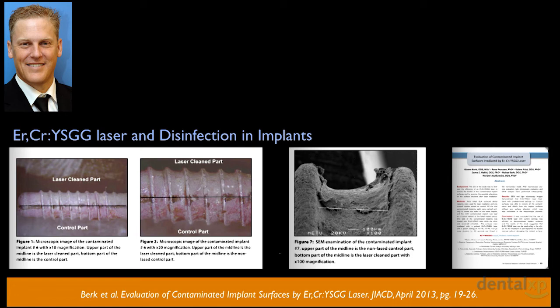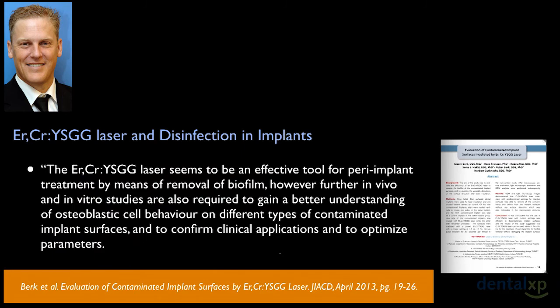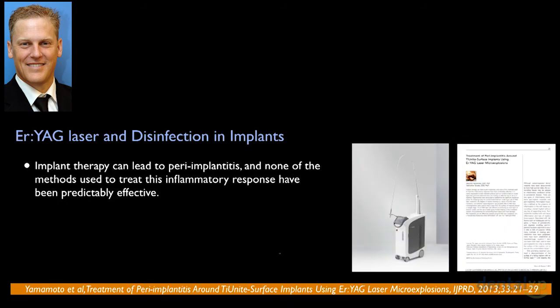Well, Burke and her group in 2013 published an article that showed tremendous removal of the biofilm. You can see the laser clean portion up above and the control part with the biofilm below. The macro results were confirmed by the SEM, where you can see that the laser, where it stopped, the biofilm continues. This exciting research, they concluded that perhaps the laser could be used for peri-implant treatment for the removal of the biofilm. But they actually cautioned us and said better understanding of osteoblasts to this clean surface needs to be done before they could suggest this as a mechanism.